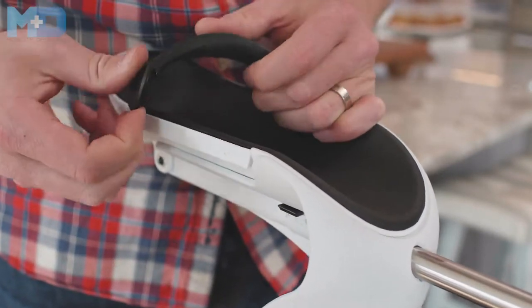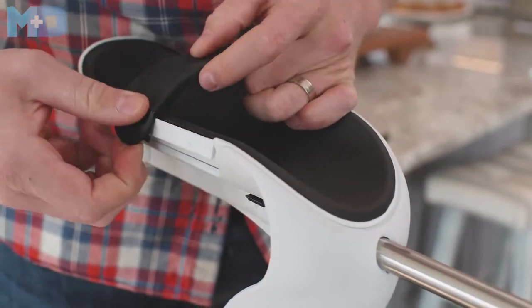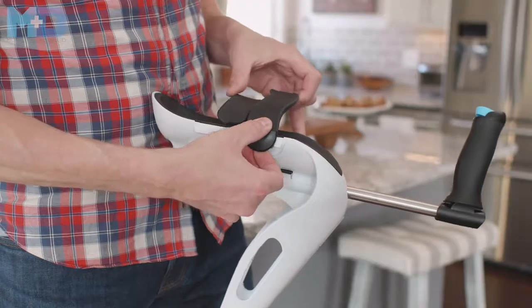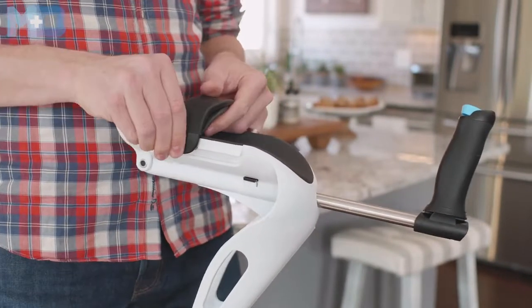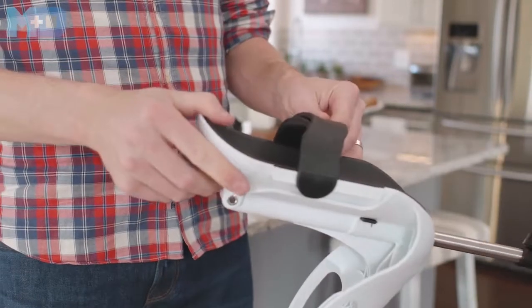To put your armband back on, make sure these top teeth are aligned with the top of the rail. You put them on like so, on both sides, and then click into place. You can easily move it to the other end of the rail, like so, or overlap your armbands for a more snug fit, like so.